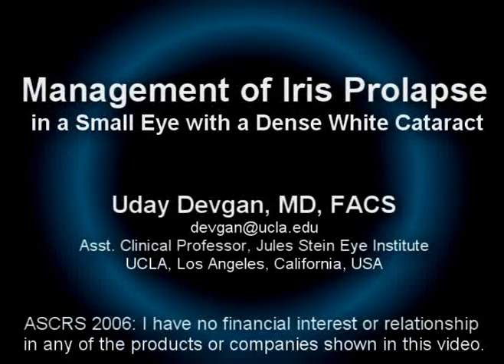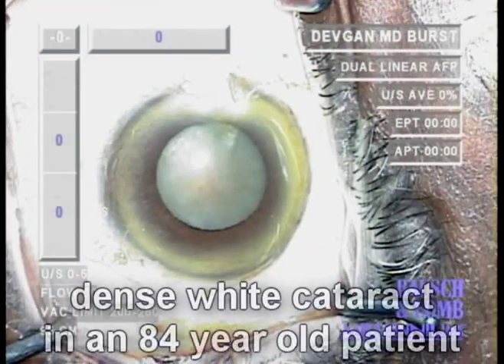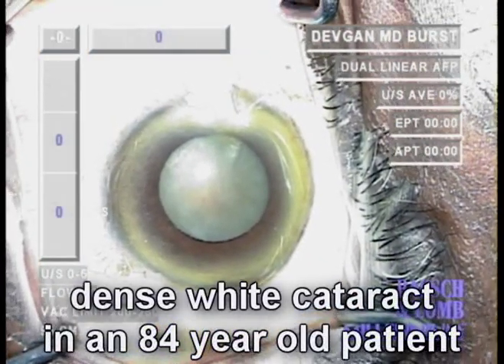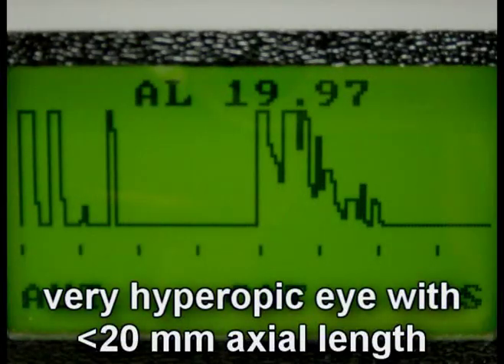Management of iris prolapse in a small eye with a dense white cataract. We have an elderly patient with a very small eye and a very dense white cataract. When we look at the axial length, we see it's less than 20 millimeters and the patient is very hyperopic.